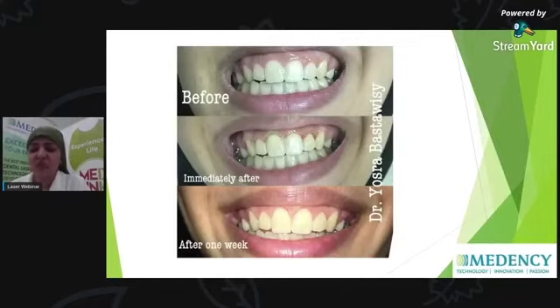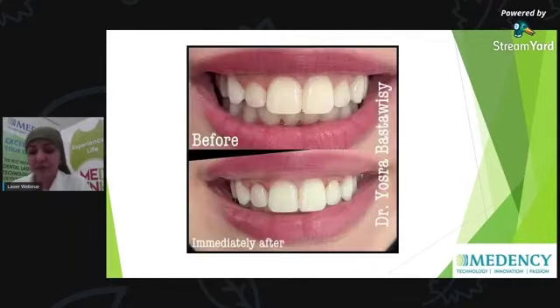Okay, this is a case I've done. We may say it is a gingival recontouring more than a gingivectomy. You can see here the before picture, the patient suffering from a gummy smile, and immediately after it is perfect, a blood-free environment. You can do the decontamination after gingivectomy. The patient is smiling and she doesn't feel any pain. And after 1 week, fully healed, there is no inflammation, and it's perfect.